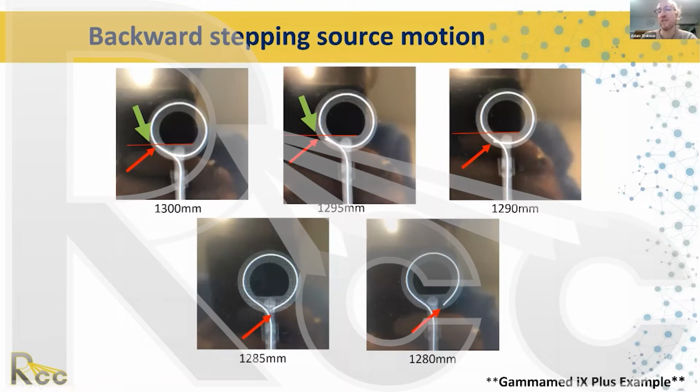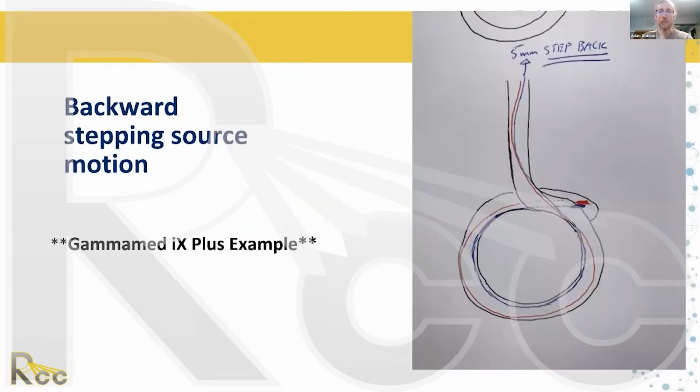So you've got a variable step size. Over your first 5 millimeters of dwell positions, it's only moved about 1 millimeter. In the subsequent dwell positions, it moves approximately 5 millimeters per step in equal step sizes. So that's important. We can't use those first dwell positions where there's variable step size, because your afterloader and your TPS can't program in variable step size. It only moves in your TPS by fixed step sizes.